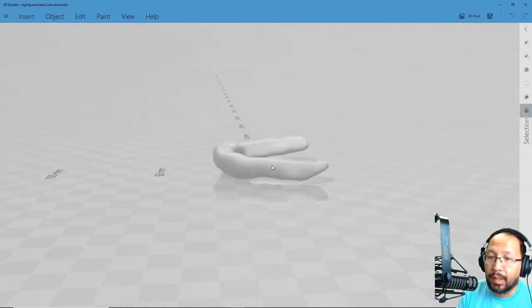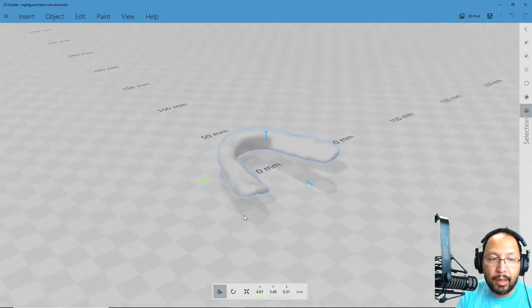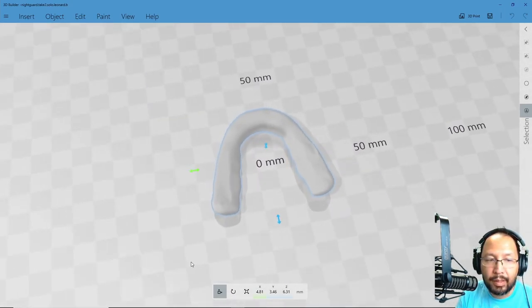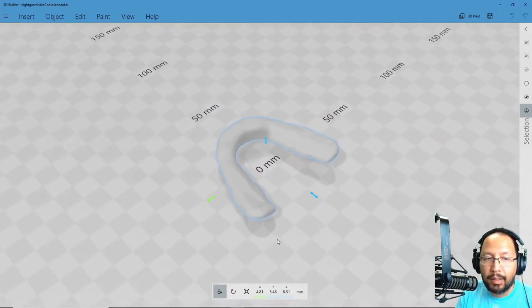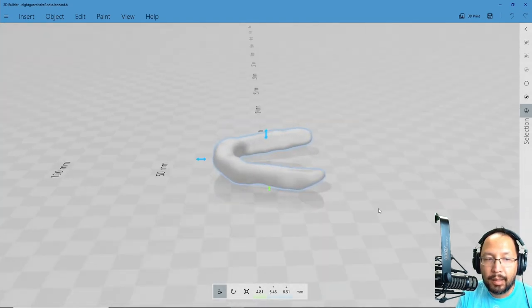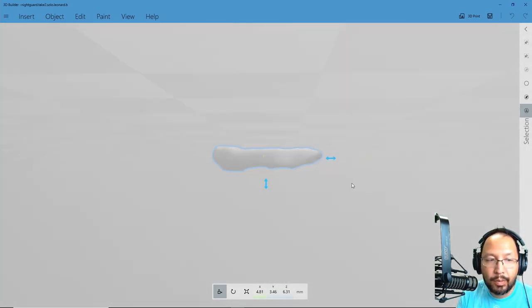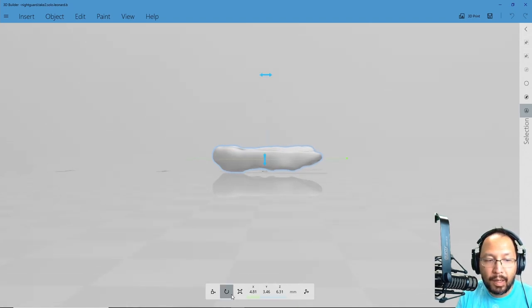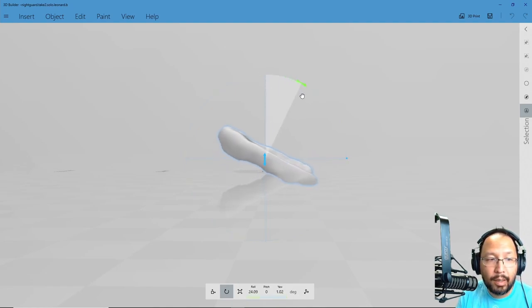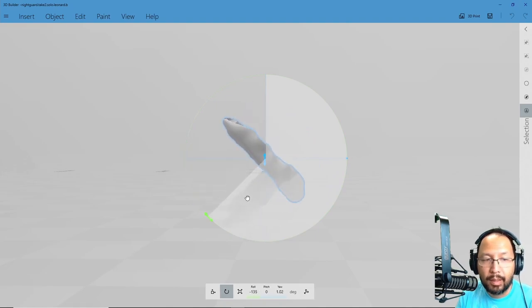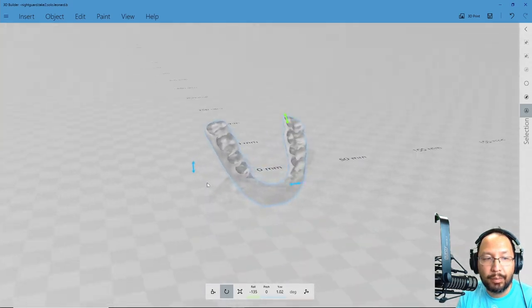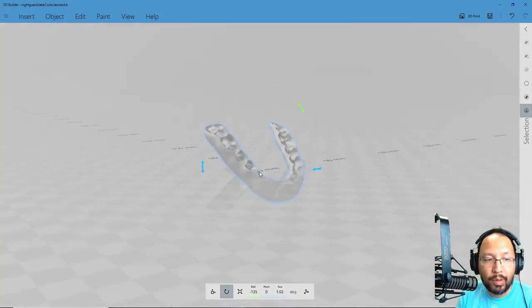I'm going to go ahead and click on the file once with my left button. In 3D Builder, you're going to use your left button to rotate, and we're going to go ahead and go over here so we can look at it from the side angle. I'm going to hit the rotate, and then I'm going to change the pitch next. We've changed the yaw. Now we're going to change the pitch to a 45-degree angle, or in this case, 135.